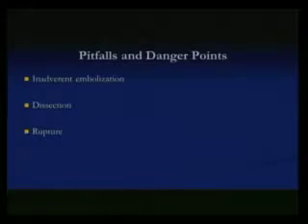So pitfalls and danger points, whenever it's a peripheral intervention, I usually discuss with the residents: there's a possibility of embolization, there's a possibility of dissection, there's a possibility of rupture. So you have to explain everything to the patient also before you start the procedure.